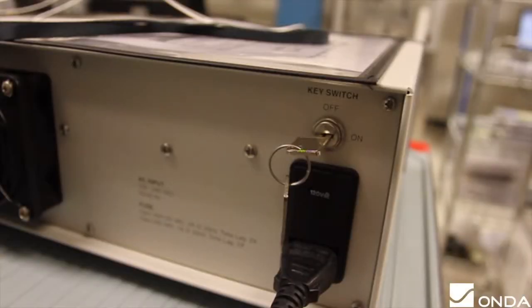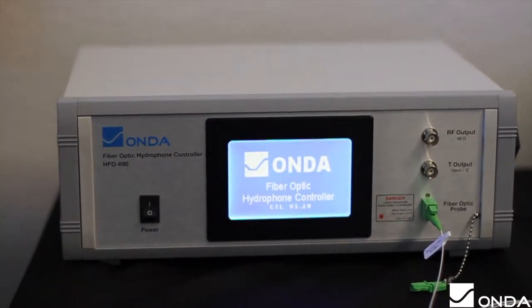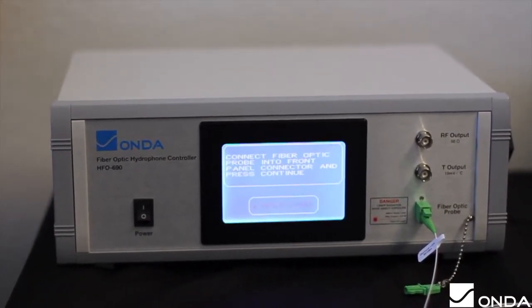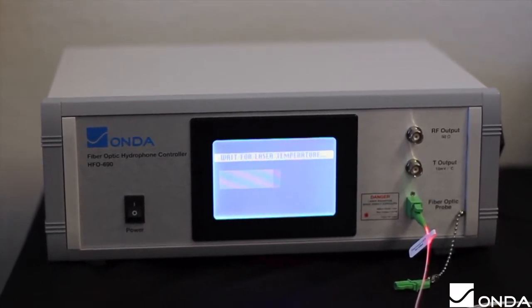To set up the HFO, make sure that the key switch on the rear panel is in the on position before turning on the front panel power switch. The system will then start the initialization process and conduct a self-test.